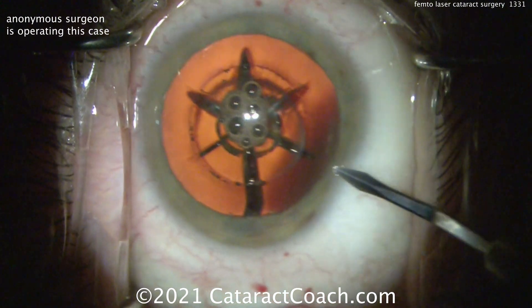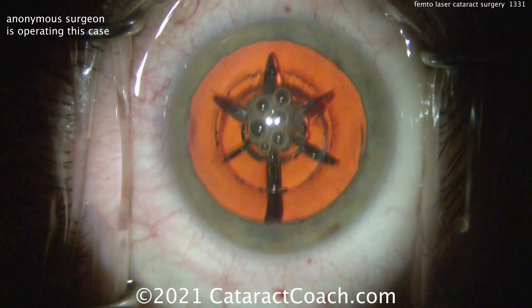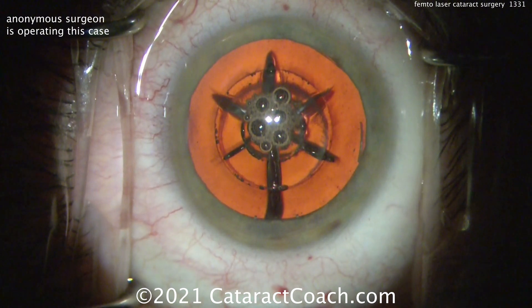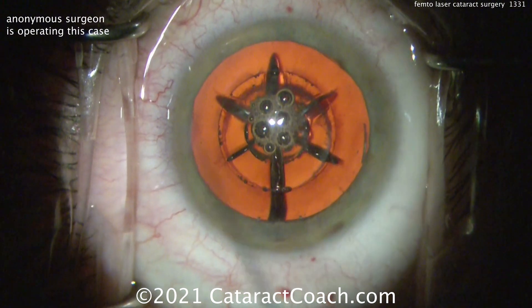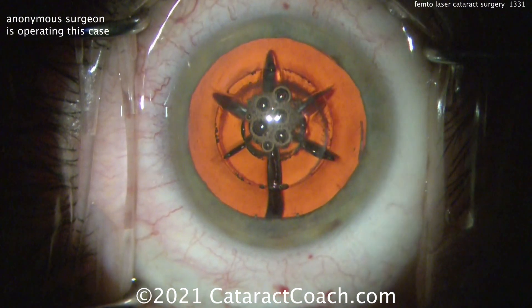So we'll do the incision, the paracentesis, the capsulotomy. There are astigmatic treatments on the cornea. You can see the nucleus has been divided into sextants — one-sixth pieces — and there's even a little bit of central nuclear softening being done here.